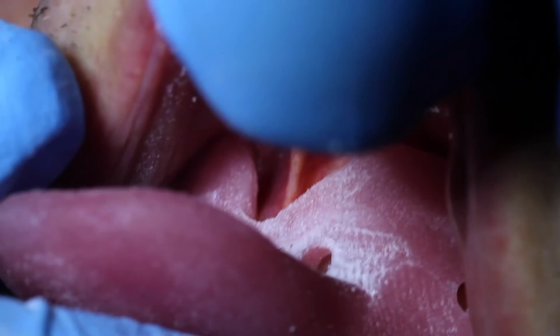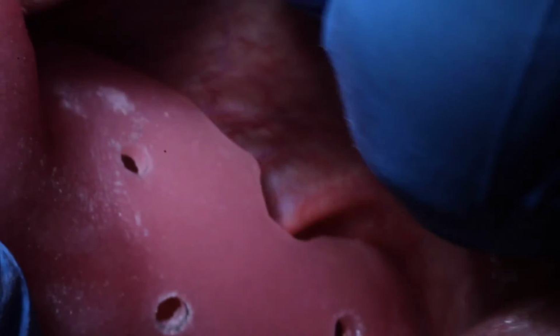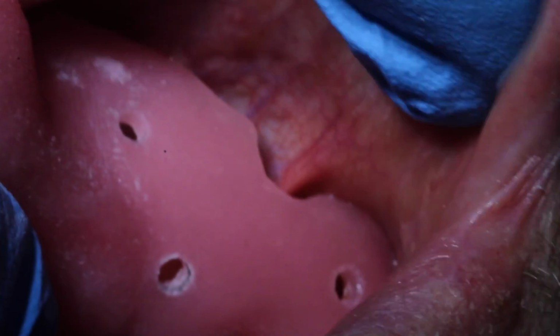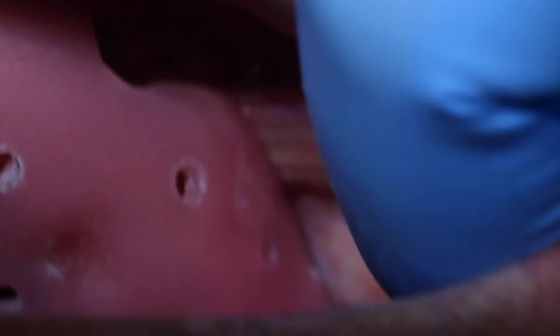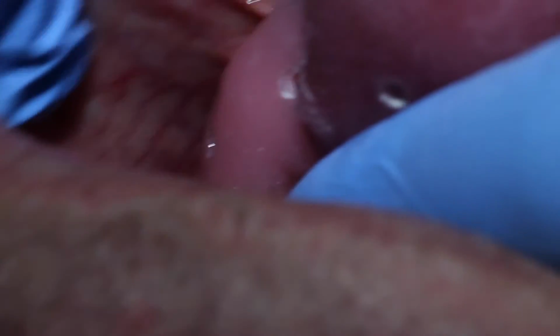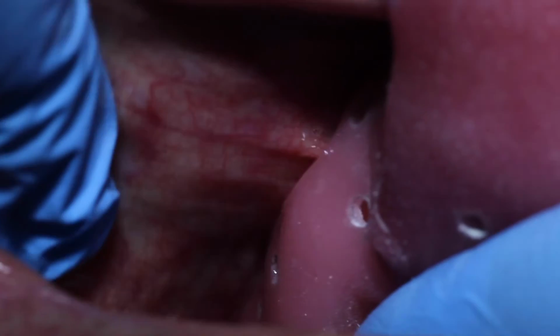I'm going to go to the side here. That one's good too. That tissue looks like it can move around freely without that tray pinching. And here, let's look at a couple more sites. Now I'm looking at the distal aspect, so all the way in the back. That looks pretty good. It's not pushing my tray out of the way.